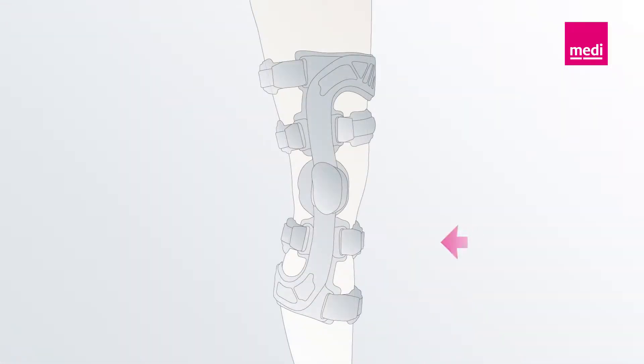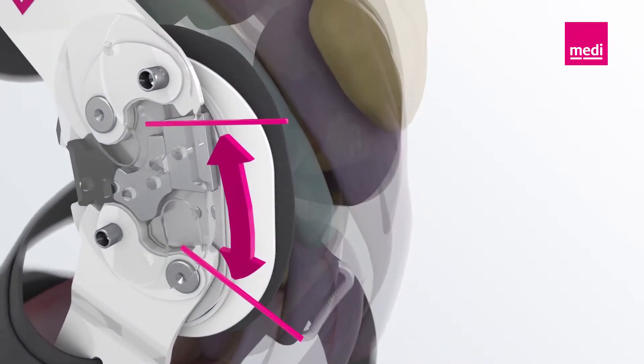The sophisticated frame system ensures optimum stabilization of the knee joint based on the four-point principle, that is, after rupture of the anterior cruciate ligament.